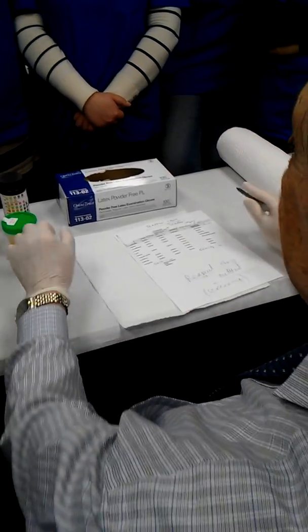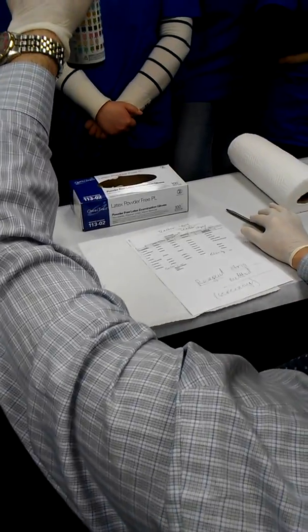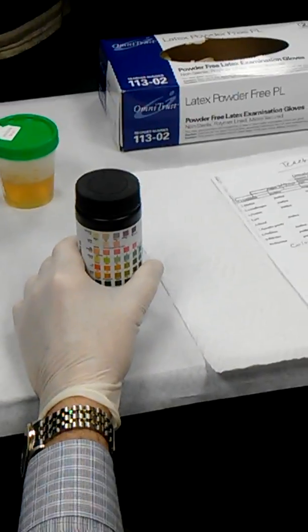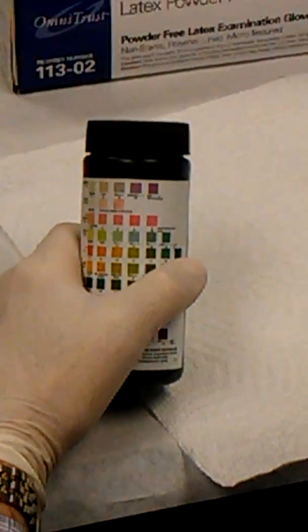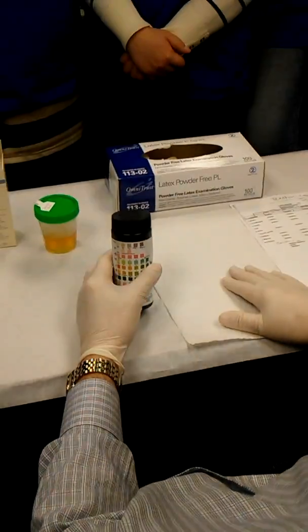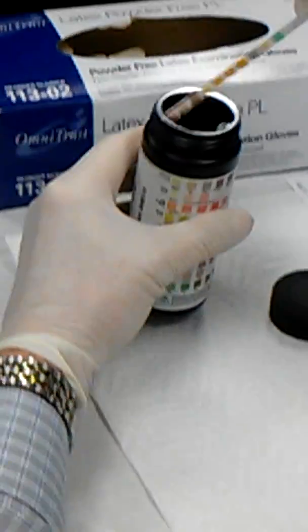Okay, so to detect something in the urine, we have reagent strips. That's why we call this method reagent strip method. It will be on the table, and you will be looking at this paper, and you will be doing the same thing that I'm doing right now. Okay, reagent strips. So we have strips, urine strips, right?